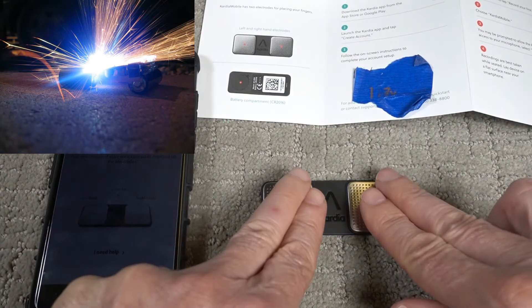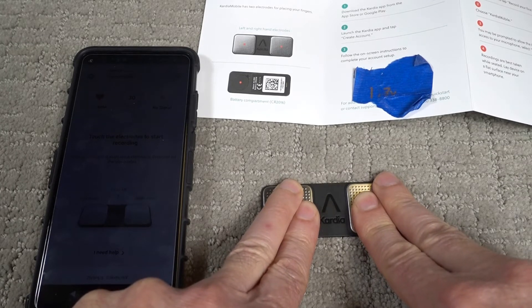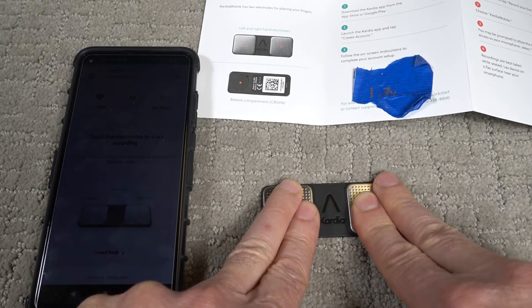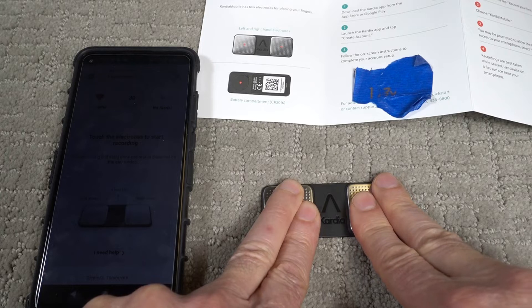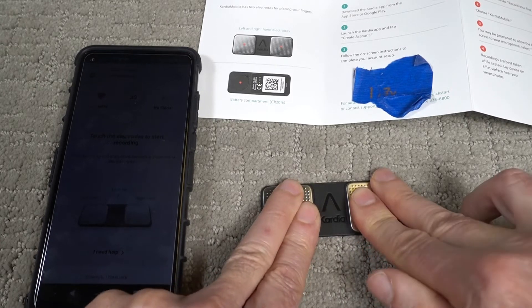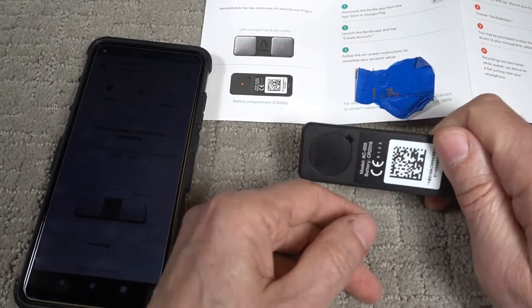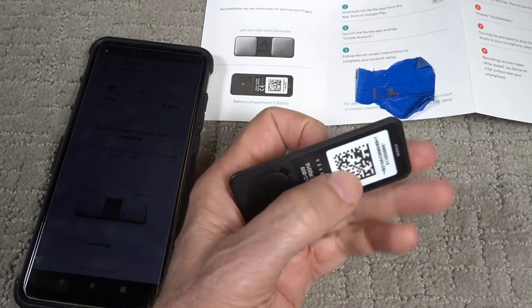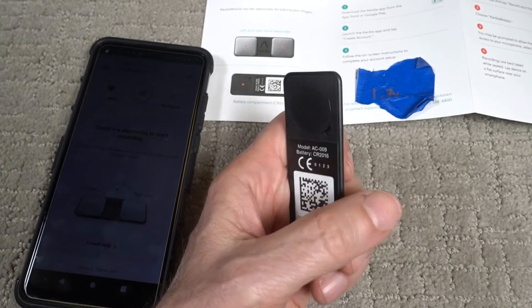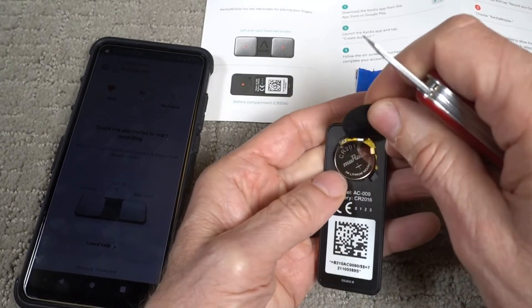Touch electrodes to start recording. Your recording will start once contact is detected on the electrodes. I am in contact, so let's get going — it hasn't started yet. I wonder if I need a battery. Let's check — the battery it's supposed to use is a CR2016. There's definitely a battery in there.